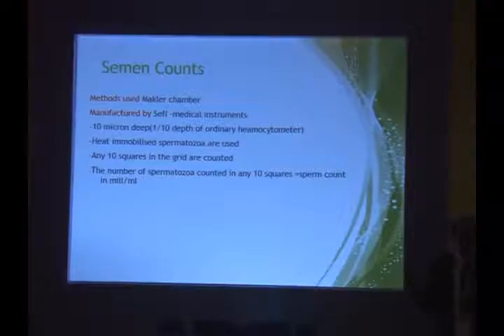Now that has addressed all issues about what is the motility, how to score it, A B C D. It has addressed all the issues about use of Makler, how to count in Makler vis-a-vis Neubauer's chamber. So in WHO manual 2010, you will not find a mention of Makler at all, not even under optional. Okay.